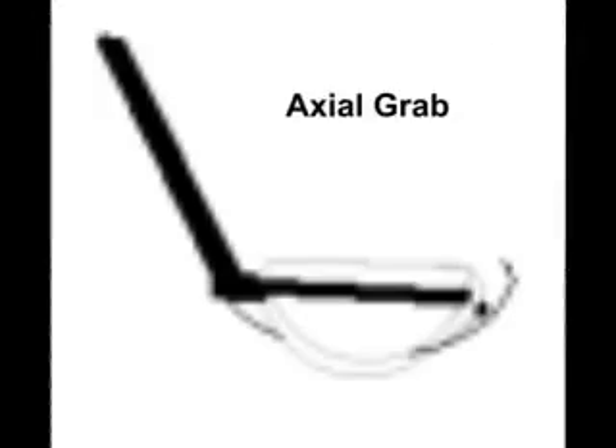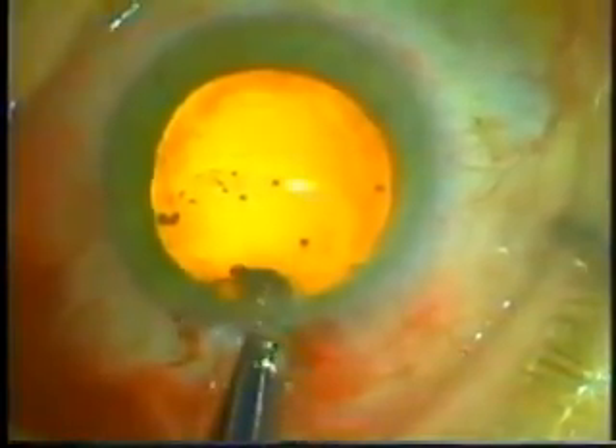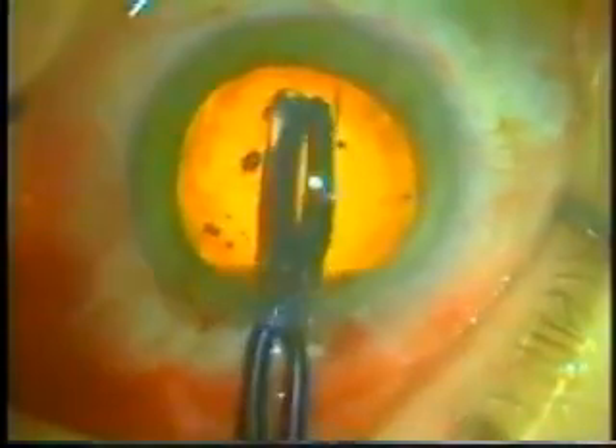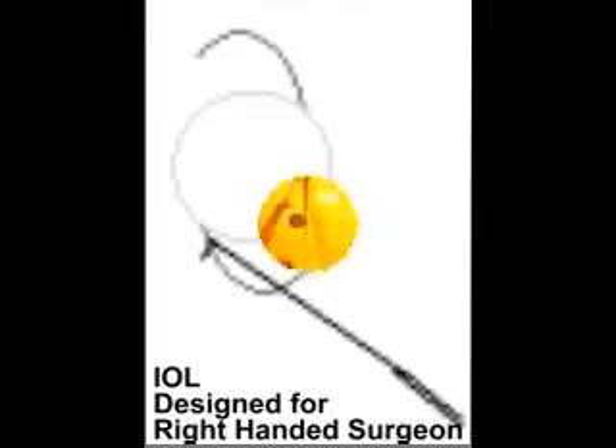Here you can see the forcep grabbing the intraocular lens. A mustache grab refers to the haptics looking like a mustache. An axial grab is 90 degrees different and is the more common grab — it allows a smaller incision as the haptics don't get in the way as much. So here's an axial grab with the forcep. We're going to pay attention to the haptics as they go in to make sure the lens is right side up. You can see that haptic is going in nicely. Now we're releasing the forcep, which is sticking a little bit — not uncommon with this acrylic lens — so it's pushed away with a Beaver spatula. These lenses are designed for right-handed people, so that's another way to make sure it's right side up.